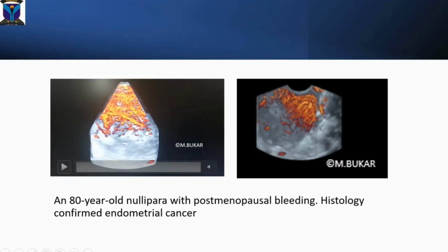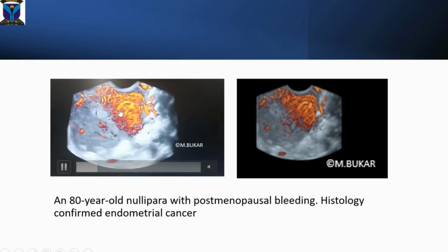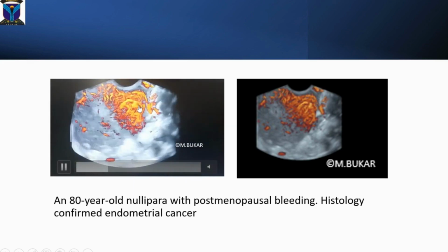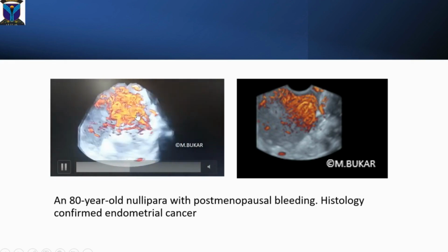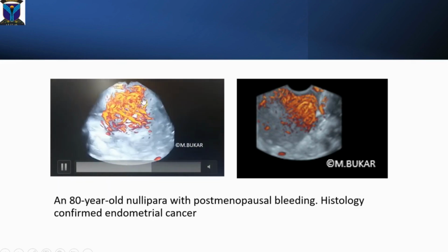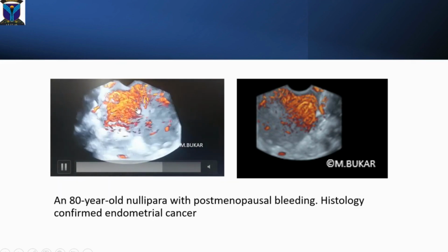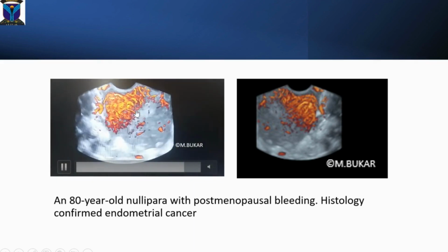This was a patient with endometrial cancer. Look at the density of vessels here, the chaotic appearance, and the single loop. Look at the riotous arrangements of these vessels. The dilatation, the looping, stenosis, bridging, branching, and all these features are seen on this single loop.